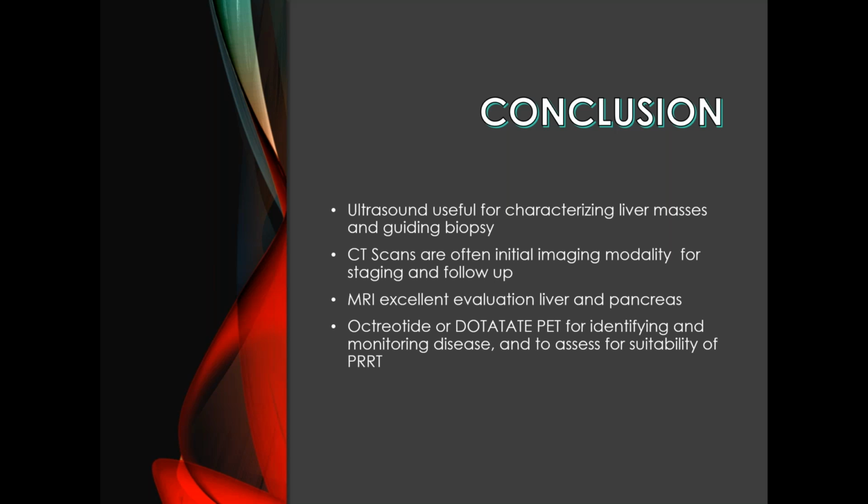In terms of the carcinoid neuroendocrine tumors, there are the typical and atypical carcinoids. The typical will probably have DOTA-TATE activity, so it probably would be useful for following up. Just keep in mind that when we do PET CT scans, we are using a localizer CT, so it's not as thin a cut as a dedicated CT scan.